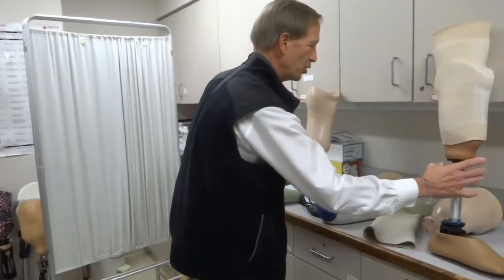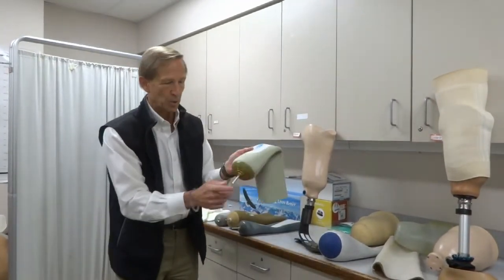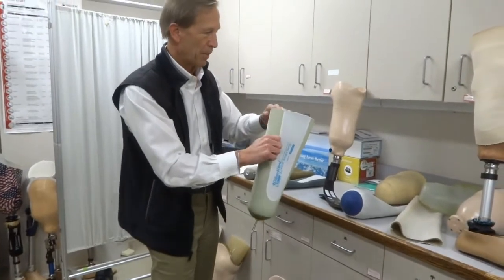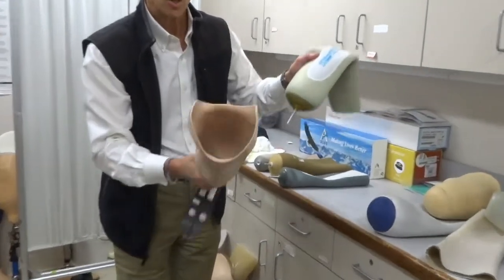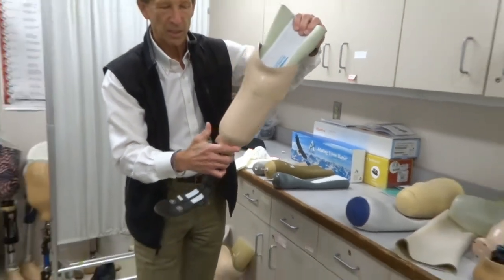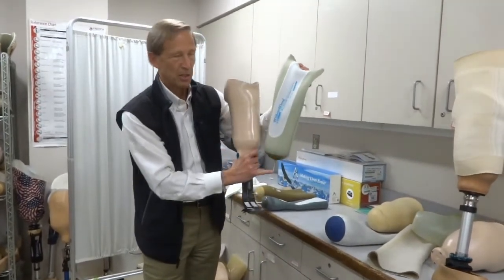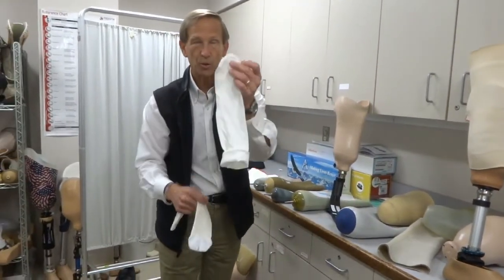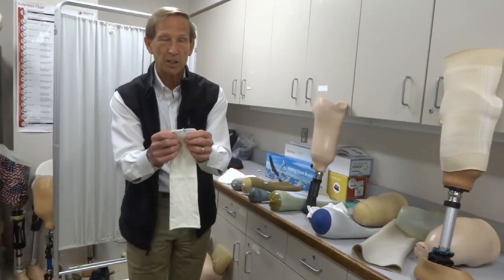However, in your more permanent prosthesis you may actually have both the soft interface and suspension all built into one. That's why this pin is in the bottom. You put this gel liner on the same way — turning it inside out and rolling it out to your skin. But then when you step into the prosthesis there's a hole in the bottom, and when you step in it locks into place. That lock mechanism prevents it from pulling out. When you want to take it off there's a button on the side you push to release. Some socks don't have holes if you're putting it over a gel that doesn't have a pin, and other socks have a hole in the bottom if you're putting it over a gel with a pin.